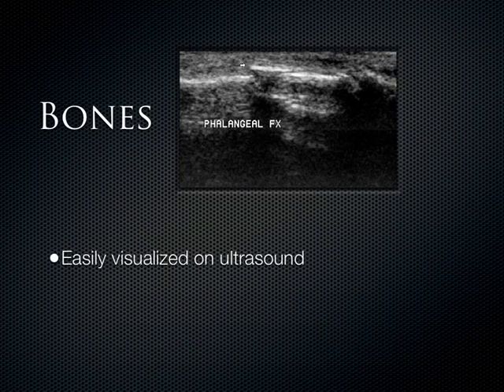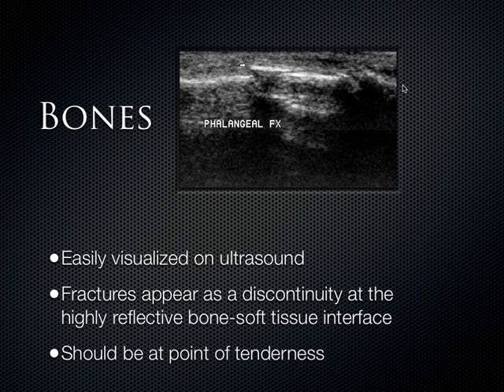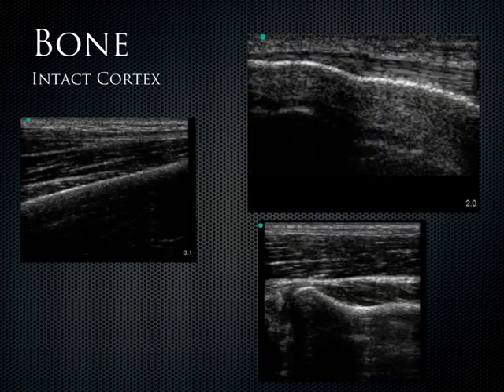And because bones are so easy to see on ultrasound, fractures are very simple, actually. And I know I'm focusing on anatomy, not pathology, but you can really see these step-offs quite easily with fractures. And the nice thing is you basically hand the transducer to the patient, say, put it where it hurts, and then you'll see the step-off.